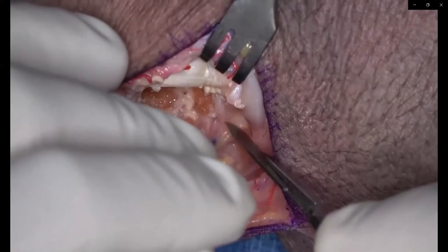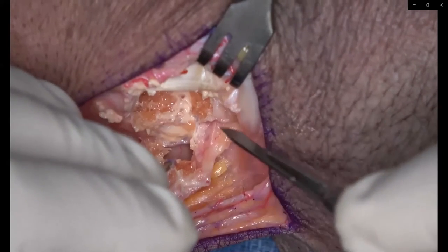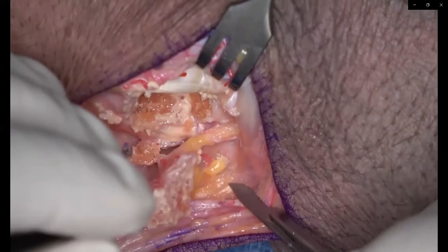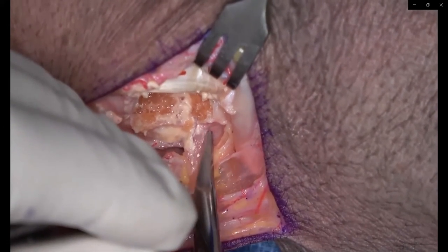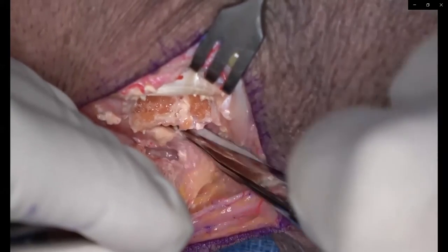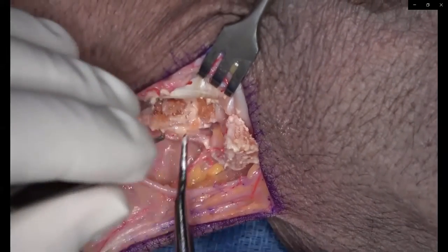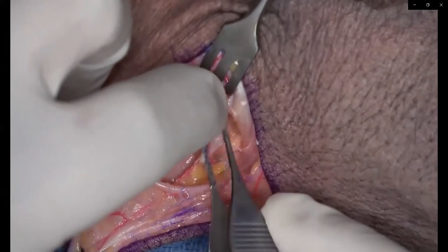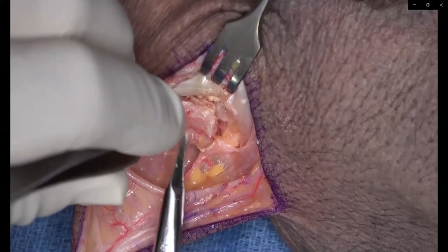Once you've made the cuts, elevate the bone graft. Be careful to elevate it with a freer elevator underneath the cancellous bone — otherwise you can separate the cortical window from the underlying cancellous bone and end up with just a cortical graft. Very carefully elevate as much cancellous bone as you can, as seen with the osteotome. Once the graft is elevated, carefully dissect the pedicle so that you have a leash that can rotate and give yourself enough room to reach the scaphoid.